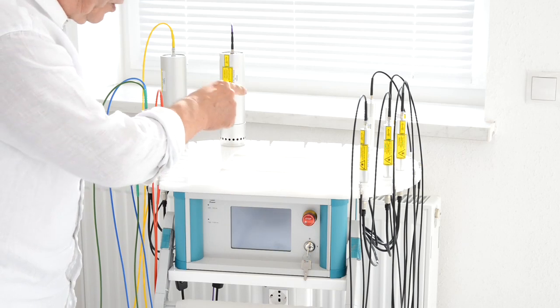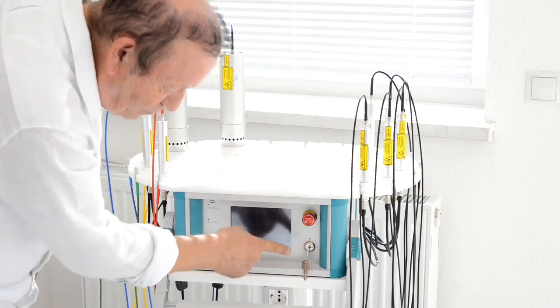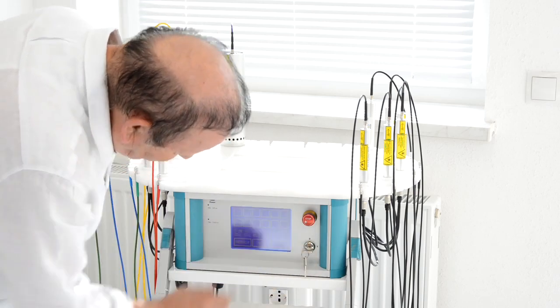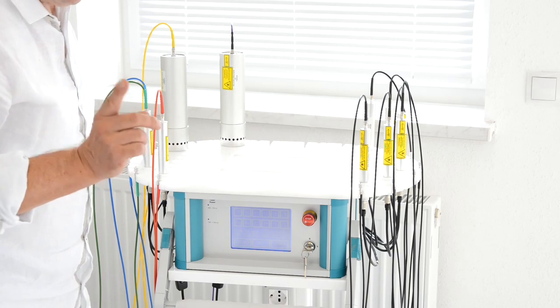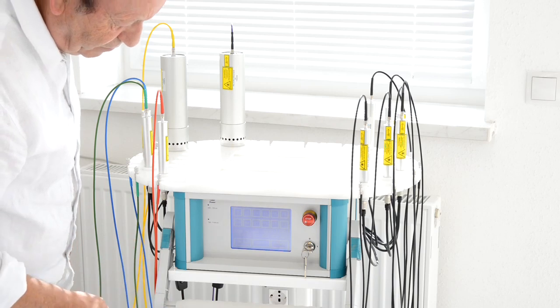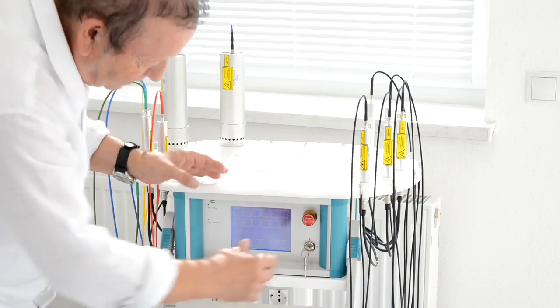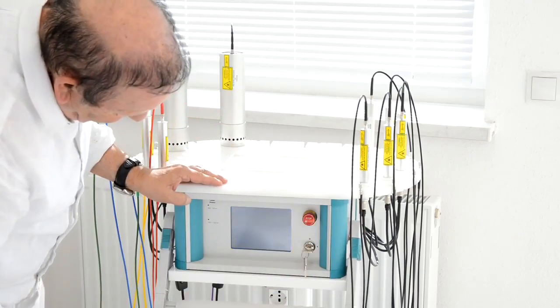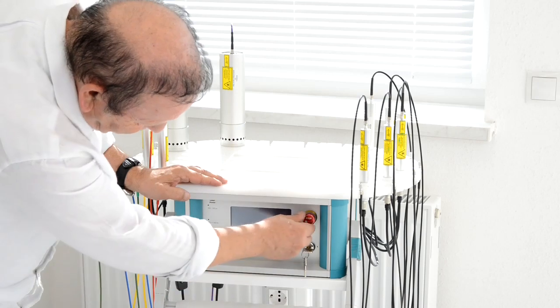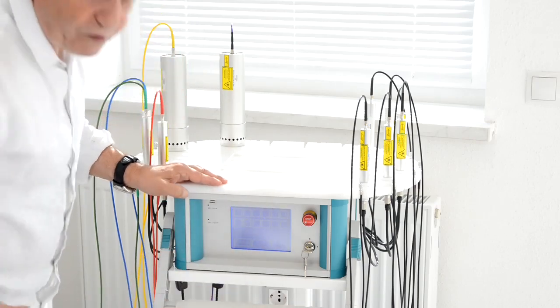So you remember that I switched on already the main switch on the back side. We have an additional switch, the so-called key switch. I switch it on and you now see that the display is working. There is a third switch on this device, a so-called emergency switch, which you will find on any laser devices on the market. So if the patients have any problems, pain or get excited, you can press the emergency switch and the device switches off immediately. To get it working again, you turn the emergency switch to the left side, it comes out, and the device is working again.